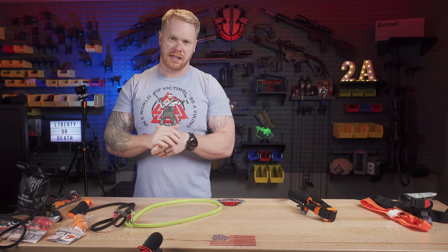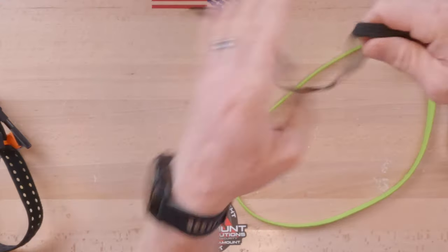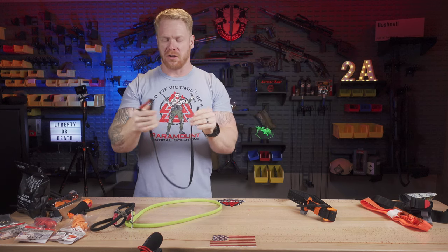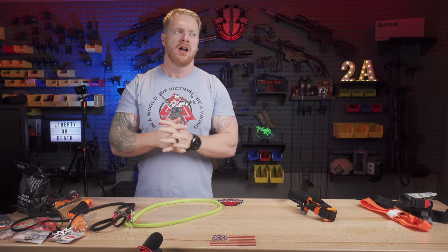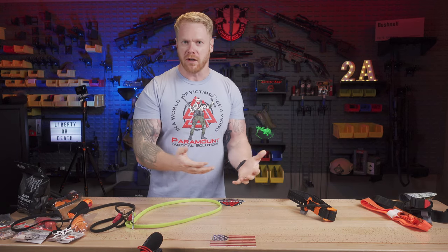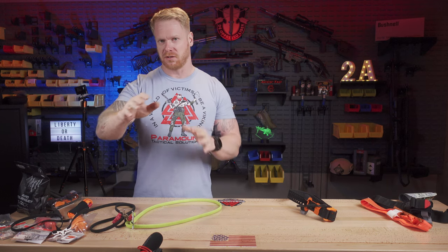Something important to know: make sure you're getting tourniquets from a reputable source. All the good ones are counterfeited regularly on Amazon, eBay, and many other sources. For instance, this is actually a counterfeit RATS tourniquet purchased on Amazon — it's about a quarter of the strength and is going to fail on you. When it comes to life-saving equipment like tourniquets, med gear, or body armor, those aren't the places to bargain-hunt. Saving a couple of bucks by buying it on Amazon or eBay could cause more harm than good.